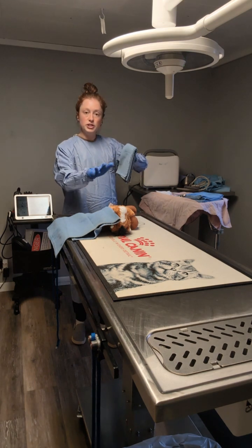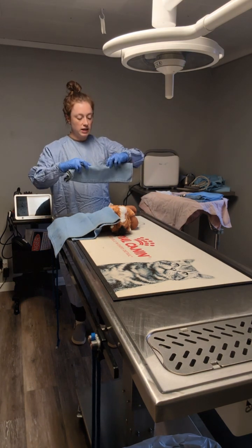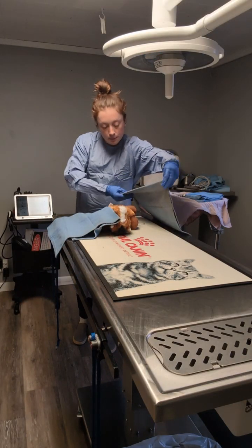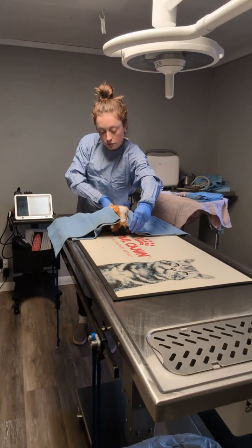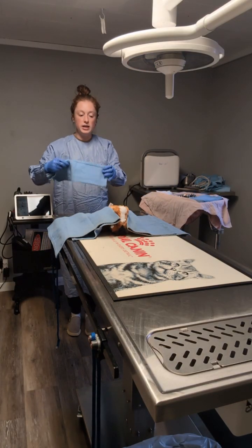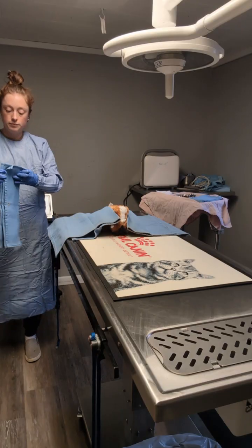I don't want to reach across the sterile field, so as best I can, I want to place the next towel on the other lateral side. Next towel I'm going to place cranially.